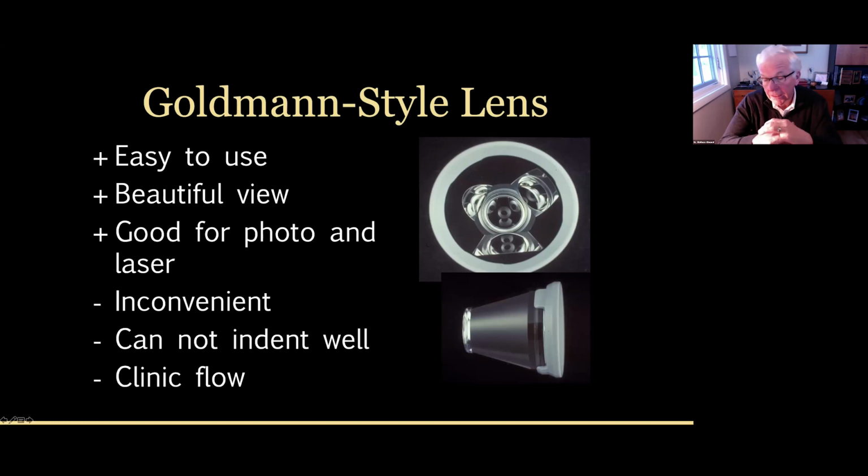In my clinic, patients come in, they have their vision and pressure checked, and we do an exam and then send them off for visual fields and maybe OCT or photography. But if they have coupling fluid, methyl cellulose, on their cornea, then the photographers and the perimetrists are not going to be happy with you. You're not going to get good results. So if you can do the gonioscopy without messing up their photography or their field, the clinic flow piece to me is a big piece of this.